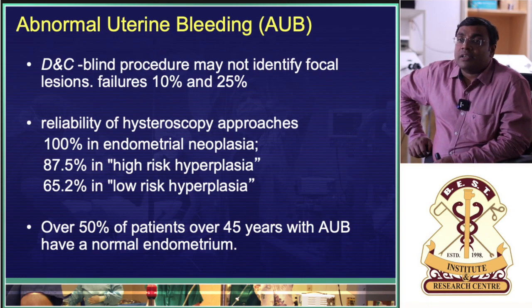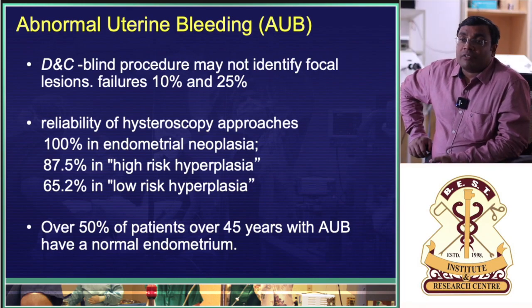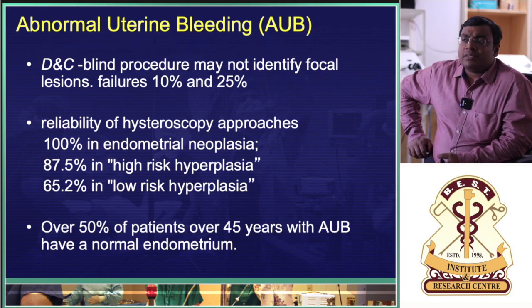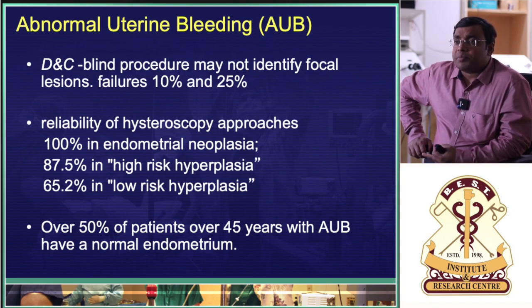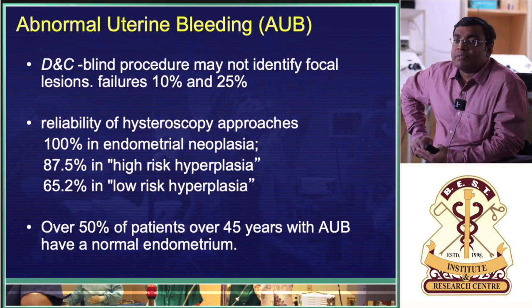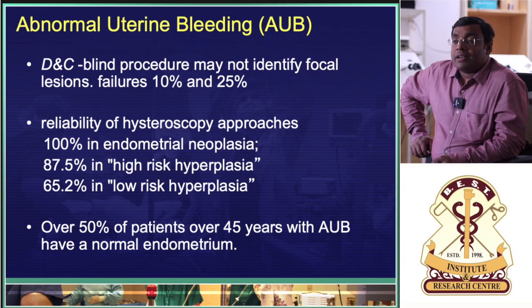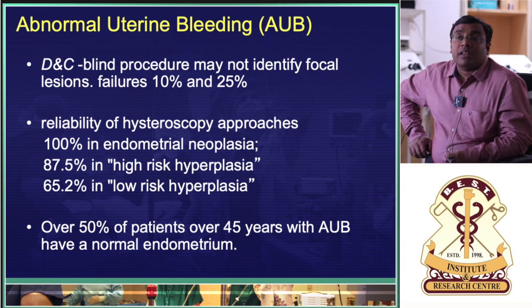She wanted one more kid. She wanted a girl child. So she said, actually, I want one more child, but I have been referred to you for hysterectomy. Then I said, nothing like that. If we do a hysteroscopy and solve the problem, your bleeding problem will be solved, and then you can conceive. When I put in a hysteroscope, there was a polyp of around 2 centimeters, which was actually missed by a blind D&C. And that blind D&C was done by a very senior doctor.